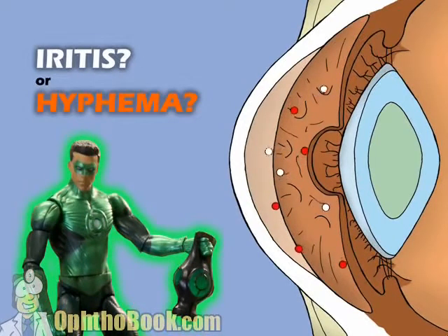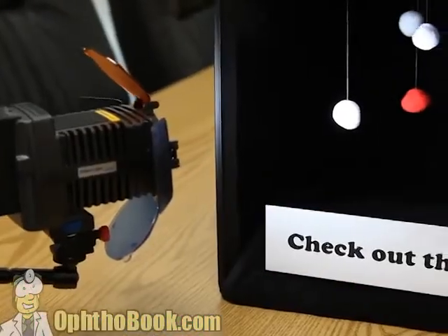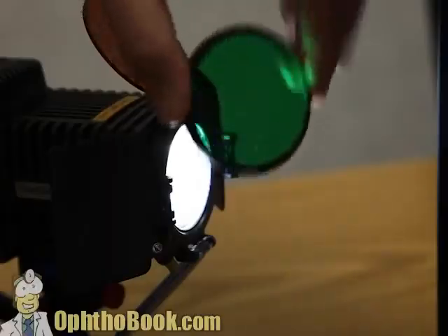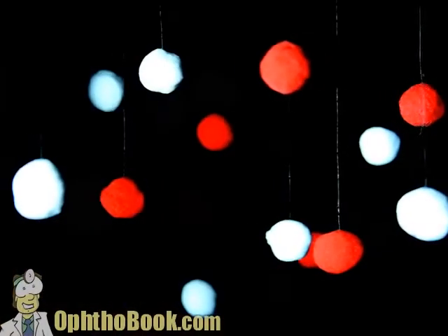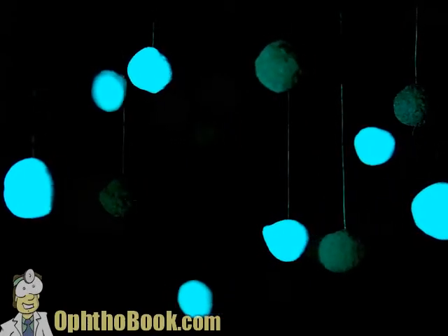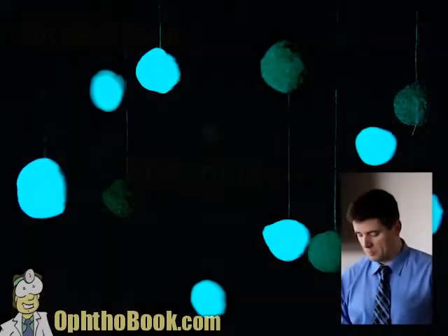And to prove it to you, I've created a little diorama. This is basically a very bright light shining into a black box to simulate the inside of the eye. And inside this box, I have white and red balls to simulate white cells and red blood cells. And if we shoot red-free light through this filter into that dark area, something very interesting happens. So white light and red-free light, the red balls seem to almost disappear. With no red light going into the eye, they can't bounce off those red cells back at us, and so they seem to disappear. A very elegant way to determine white cells, red cells, what is it? Sounds great in theory, doesn't work that well, but what a neat idea.